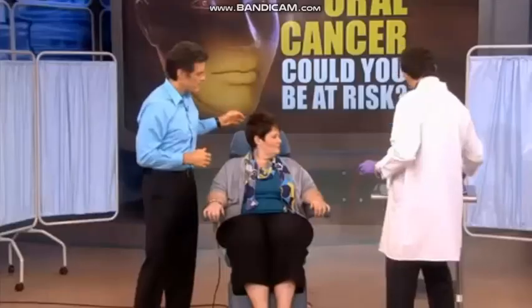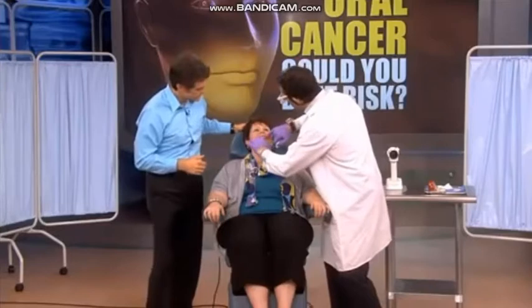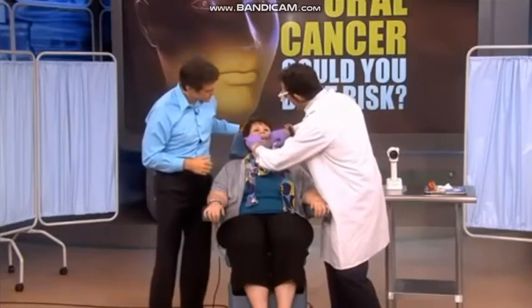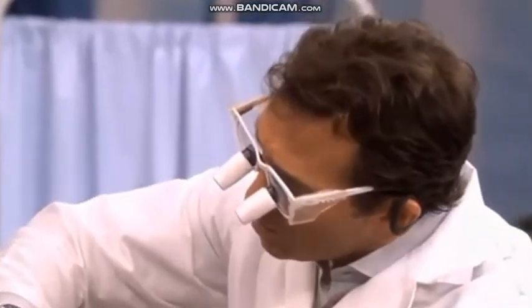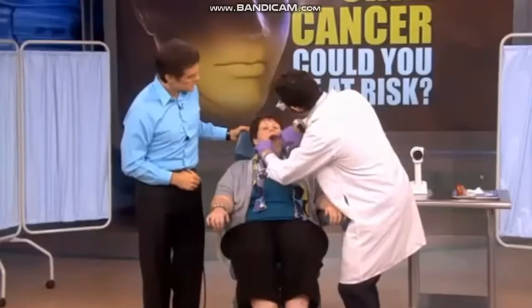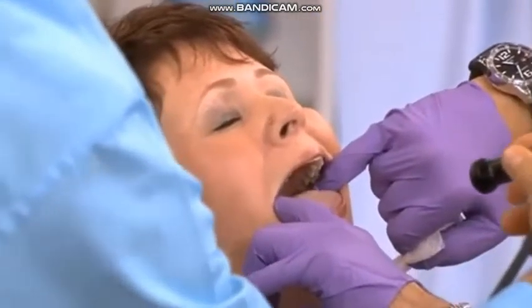But before you show me the VELscope, can you just show us what an exam looks like fundamentally? Okay. So our normal examination, we really want to look at all of the soft tissues in the mouth. So I'm going to put my loops on. Please put your head back a little bit. Open for me. And what we're looking at is the lips. We're looking at the oral and buccal mucosa. Open real big. We're looking at the cheeks. We're looking at the oropharyngeal area, the tonsil area, all the way in the back, right?